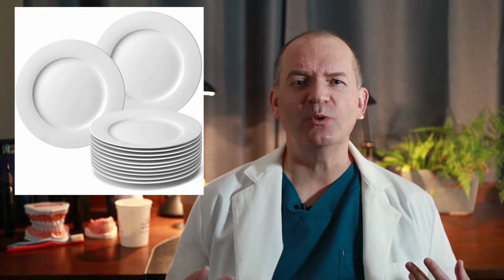A dental flipper is a layman's term for a temporary removable partial denture. Another word for it is a stay plate. For some reason, dentures used to be called plates. I'm not sure why. Does anyone watching know why? Let me know down in the comments.